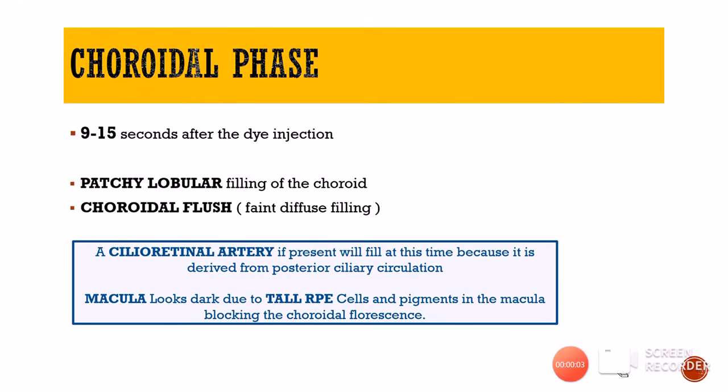As we know, the blood flow in the choroidal vessels and also in the retinal vessels can be visualized using fluorescein angiography. After we inject the dye into the peripheral veins, the sodium fluorescein is going to reach the vascular system in the eye via the blood circulation system and via the central retinal artery that I already told you about.